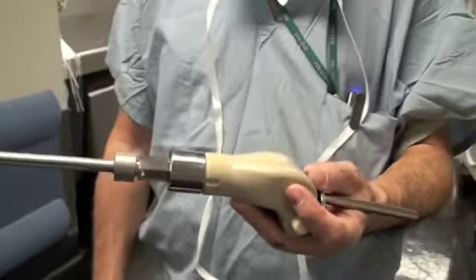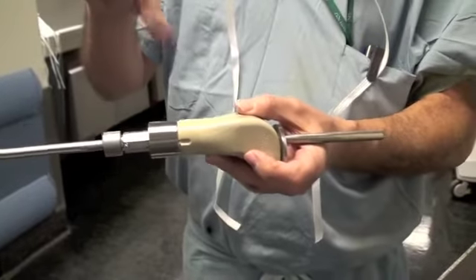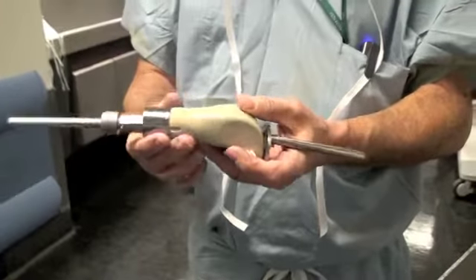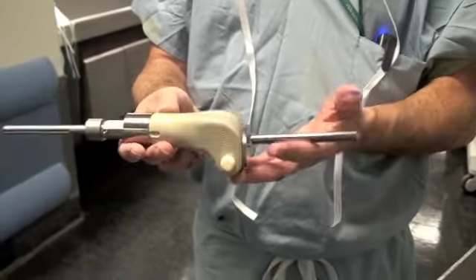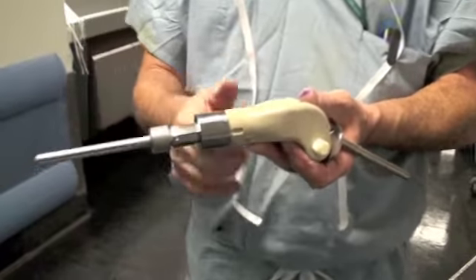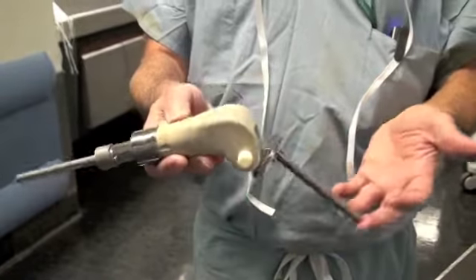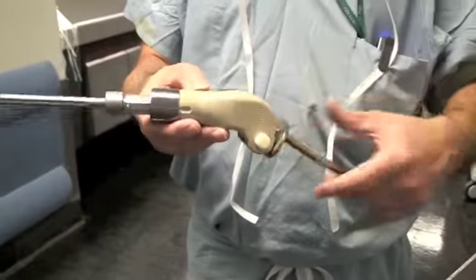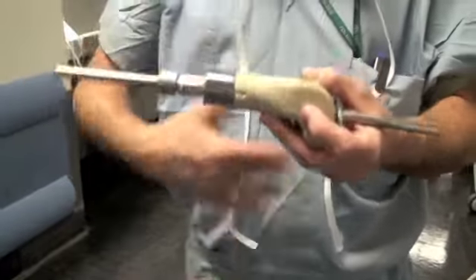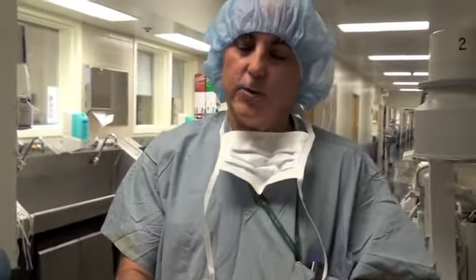Once this is inside his leg, all we need to do to expand it is put a ring around his leg that creates an electromagnetic field, which activates the device and it will lengthen — usually in 1 to 2 centimeter increments. You don't have to open the leg up; you just place the ring outside the child's thigh. It takes 20 seconds, and this device will lengthen.